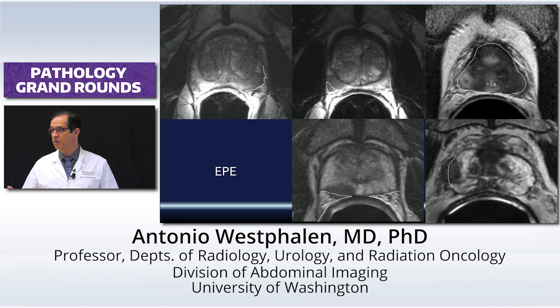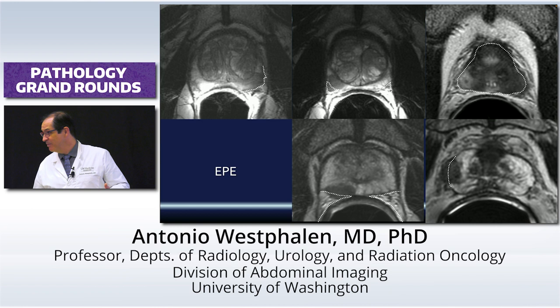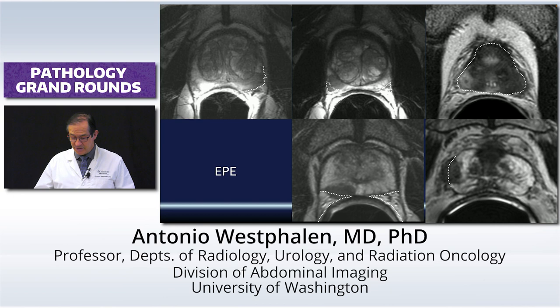Now, we can mention it, and our reports include that if the tumor abuts the periphery of the gland and it's greater than a centimeter, 1.5 centimeters, we bring up the possibility of involvement of the capsule. That's microscopic, but we cannot prove it, and it probably doesn't really matter for treatment anyway, because they can get a margin irrespective. But when we call it, you should see something ginormous there.